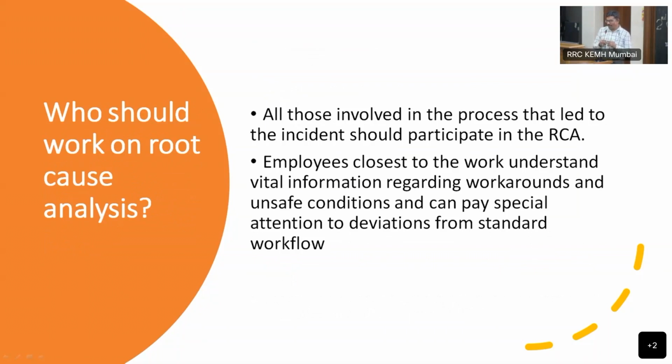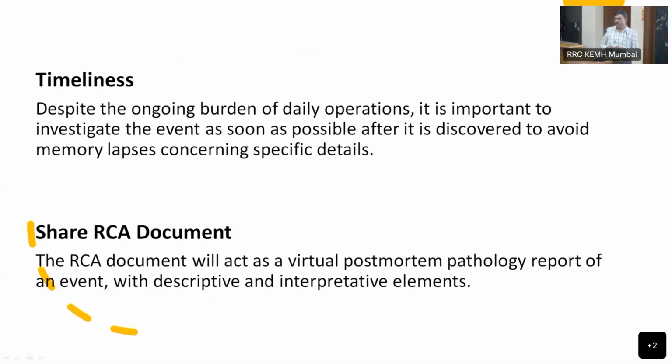So who should work on root cause analysis? I told you already. All those involved in the process that led to the incident should work. The employees closest to the work. Say, I'm giving you one example. I will take one example actually. A case I will take in the sessions also. They know the ground reality better than anybody. That's why they should be involved in the RCA.